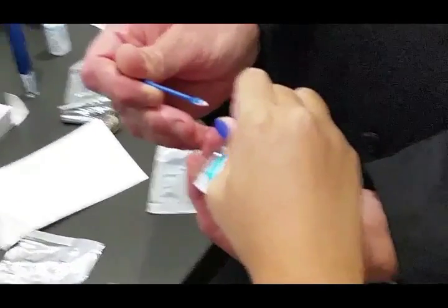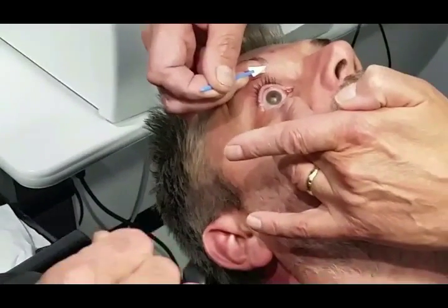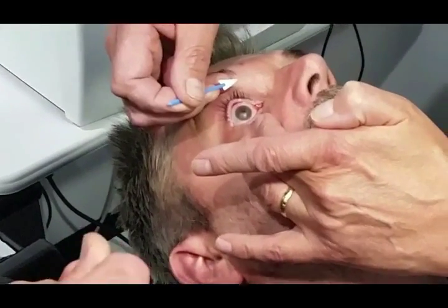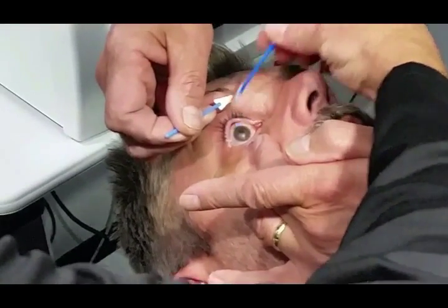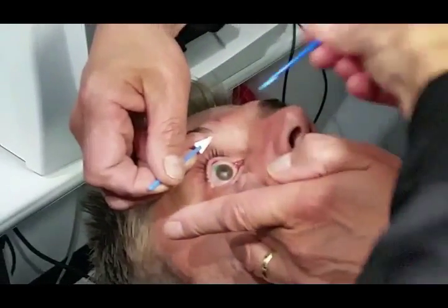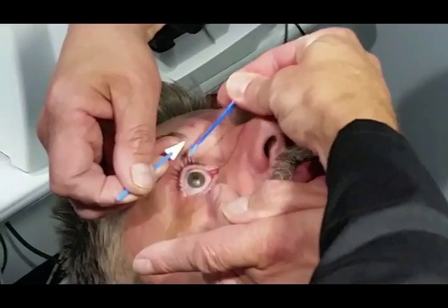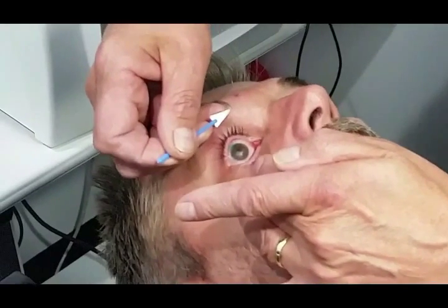Here we're mixing the sealant — two drops — and we stir for five seconds. We only have a short window after stirring before cross-linking prevents us from using the glue, so we have to move quickly and apply a dab or two, in this case right at 12 o'clock. Then we let it dry for at least 30 seconds, preferably as much as a minute, before placing the contact lens.